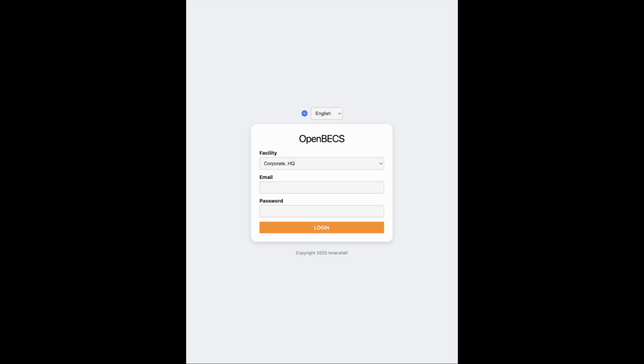Melvin here from InnerShell. You are watching the world premiere of OpenBecs, a cloud-based solution with integrated AI to help manage a plasma center, a blood donor center, or even a transfusion center.